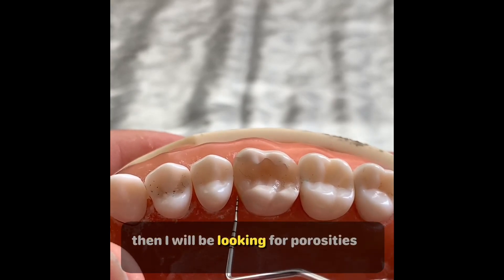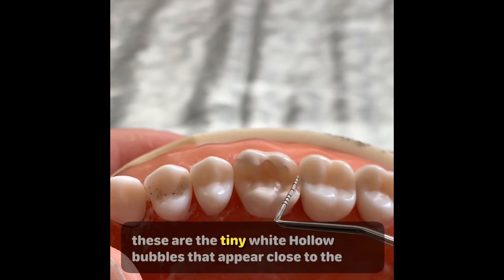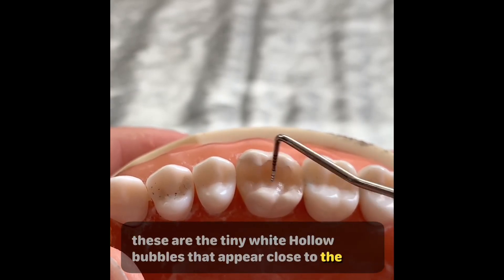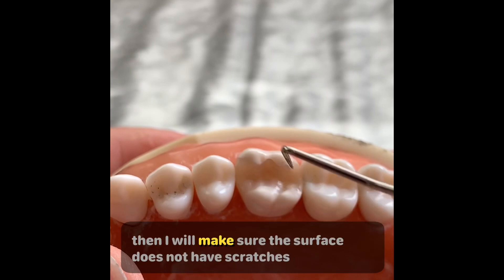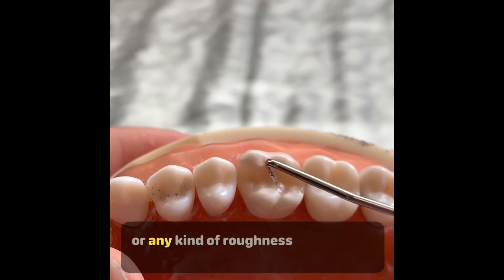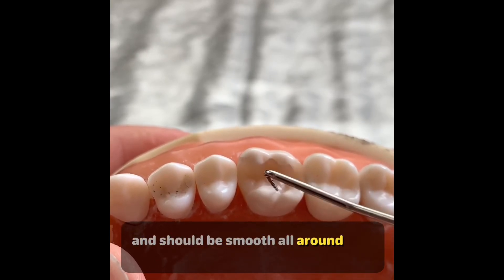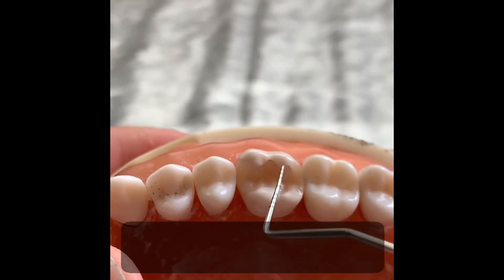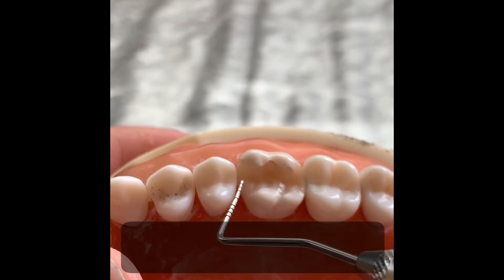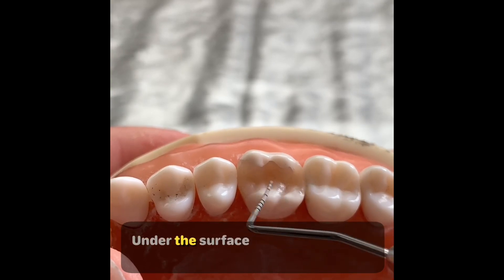Then I will be looking for porosities — these are the tiny white hollow bubbles that appear close to the surface. Then I will make sure the surface does not have scratches or any kind of roughness; it should be smooth all around. While scanning the tooth surface, I also have to ensure that there is no contamination of any kind on the surface or under the surface.